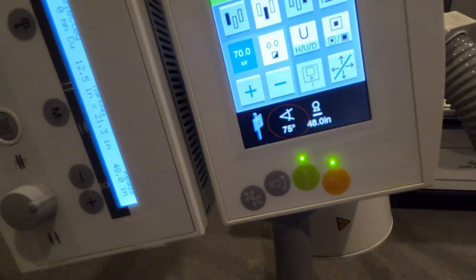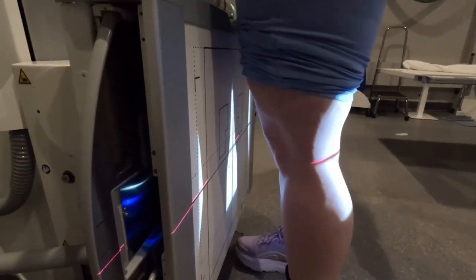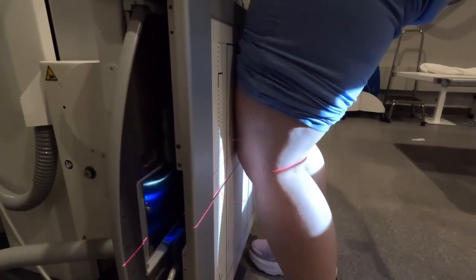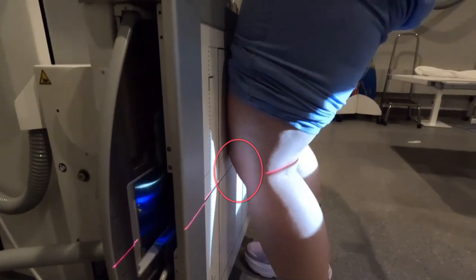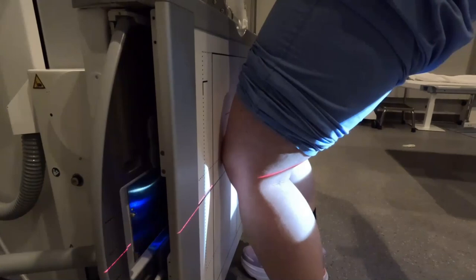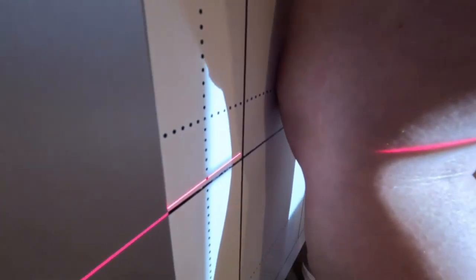Here I got 15, feet pointed forward, and we're going to have our patient bend into the board so their knees are touching it. And you can see our central ray is at the apex of the patella, and everything is in good positioning. Just going to have you sit down a little bit, get a nice 45-degree bend in those knees. That's important. You're going to get a nice tunnel by doing that.